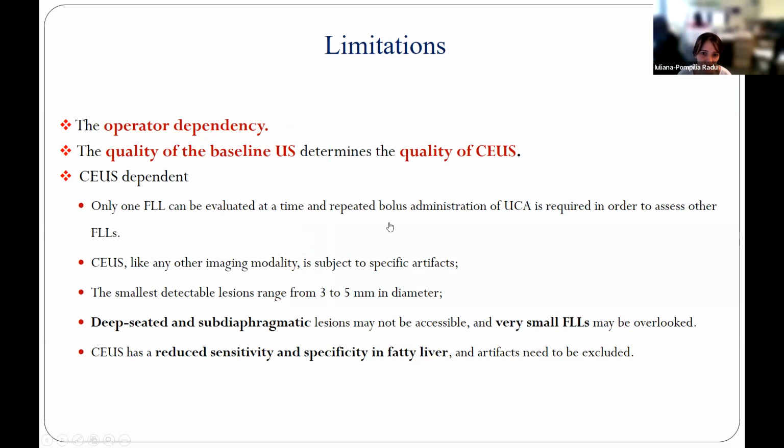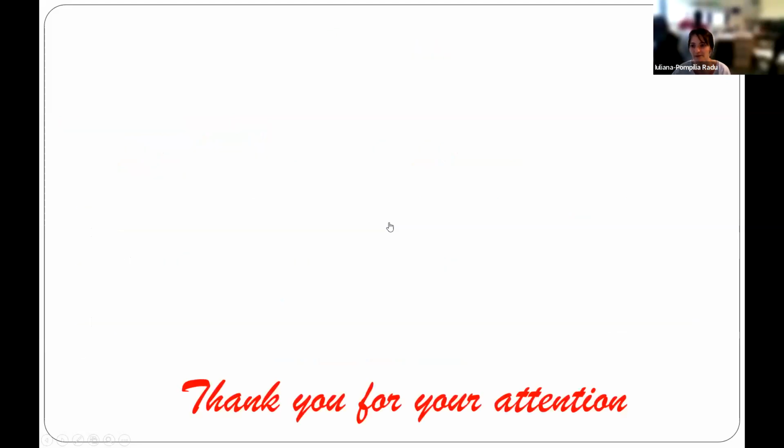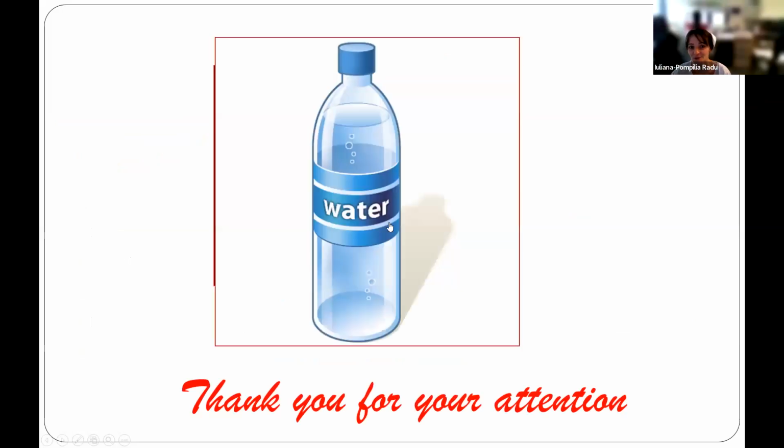The quality of contrast enhanced ultrasound is dependent on the quality of the B-mode ultrasound. And don't perform contrast enhanced ultrasound for very deeply located, also diaphragmatic lesions, or very, very small ones, because we don't obtain relevant information. And in the steatotic liver, contrast enhanced ultrasound has a reduced sensitivity and specificity. Okay, thank you very much for your attention, and don't forget, use the right bubbles.